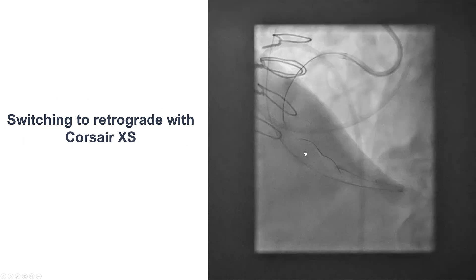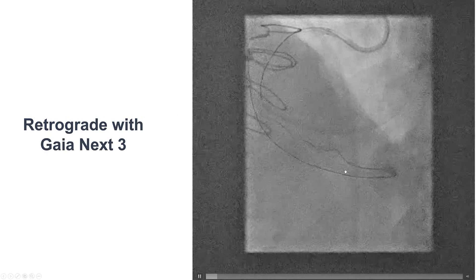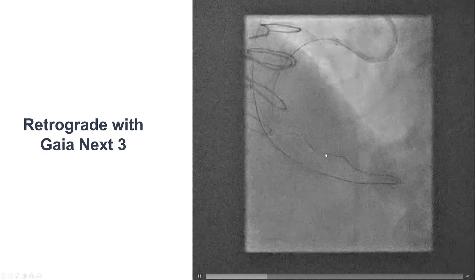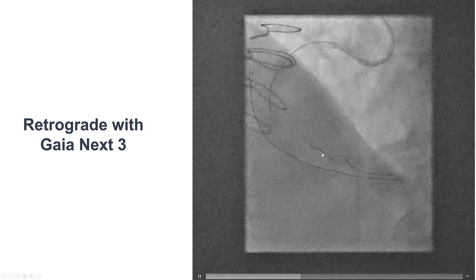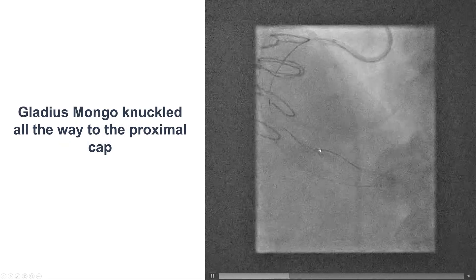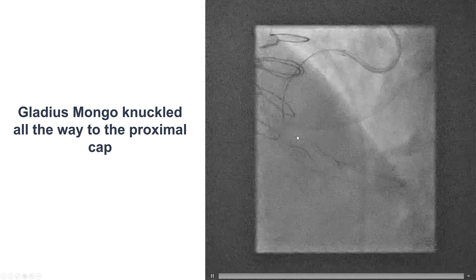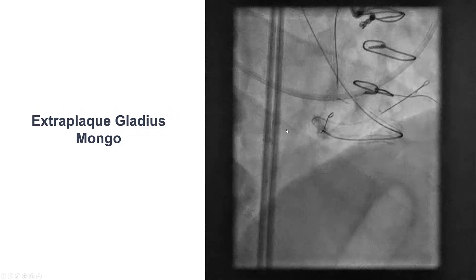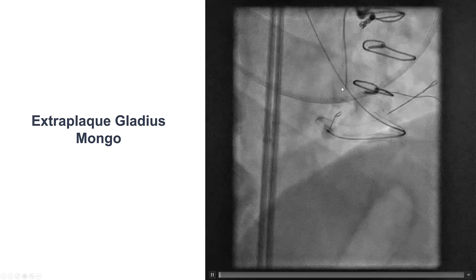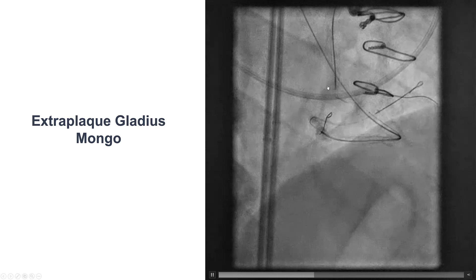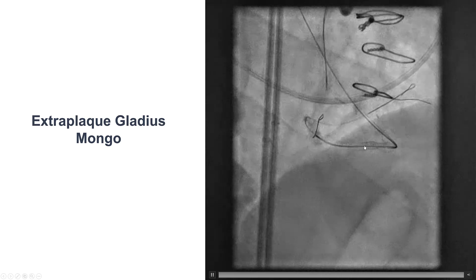Given the difficulties, we decided to switch to the retrograde approach. We used a Corsair XS microcatheter, and then using a Gaia NEX3 wire, we were able to puncture the distal cap, which was also calcified. We then knuckled a Gladius Mongo guide wire that advanced all the way to the proximal cap. At this point, we had the antegrade microcatheter, the retrograde Corsair XS going through the saphenous vein graft, and the Gladius Mongo close to the proximal cap.